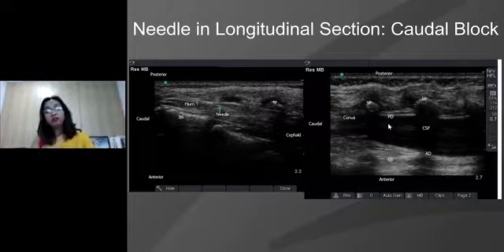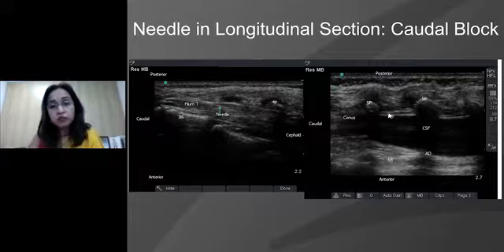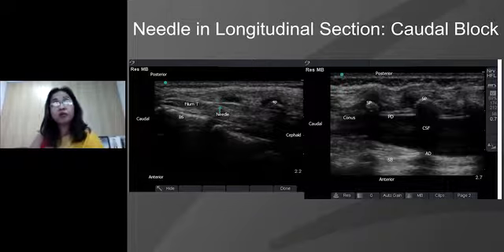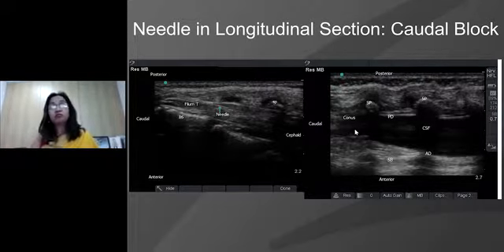So I feel if there is any place to understand the spine best with ultrasound, it is the pediatric operation theater. So having understood this particular aspect, we can now open up so many complications in our minds and understand how they can be actually diverted out or cancelled out because of what we see. The most dreaded complication of all is putting the entire local anesthetic, which is calculated for a caudal epidural, into the CSF itself. So if you see the conus and if you see the CSF, it is extremely unlikely that the needle would come.